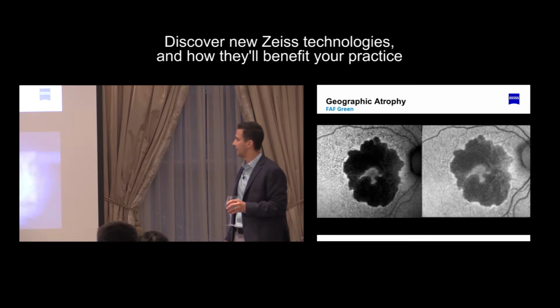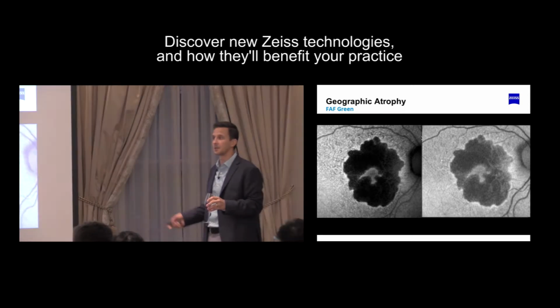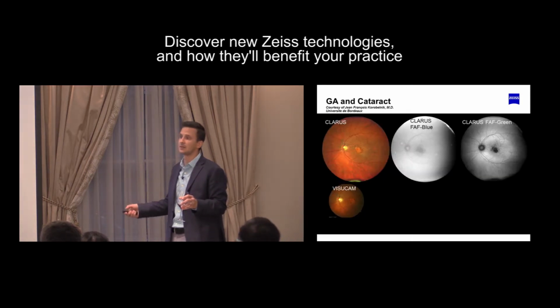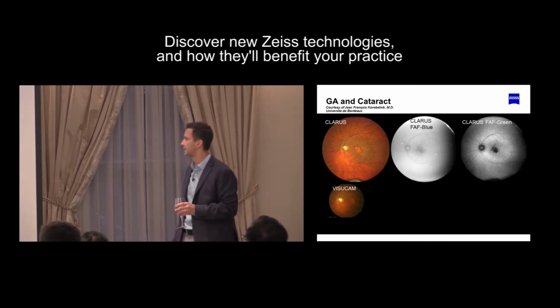FAF green here on the 2 technologies. This, again, is a true size of the image. That's a slightly distorted size of that image. These are at scale in terms of measurements and pixelation, so you can see that little bit of difference in the 2 of them. And if you're going to get an algorithm to read that, you've got to have something that is consistently repeatable from a scientific or engineering perspective.